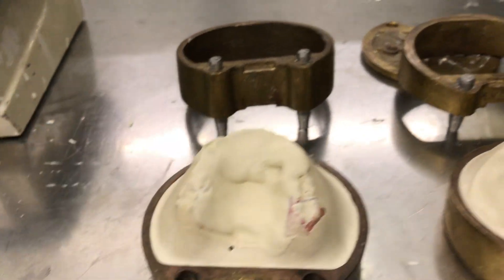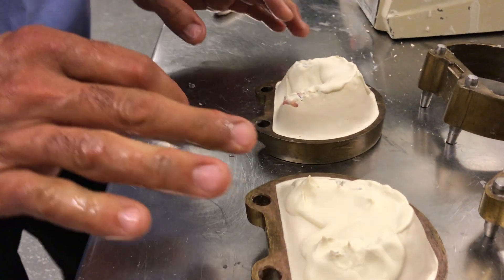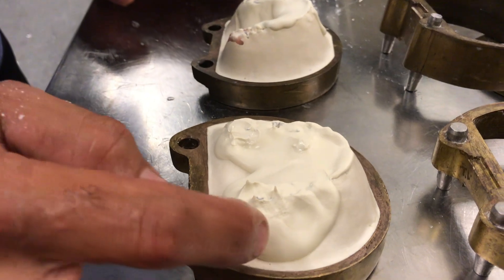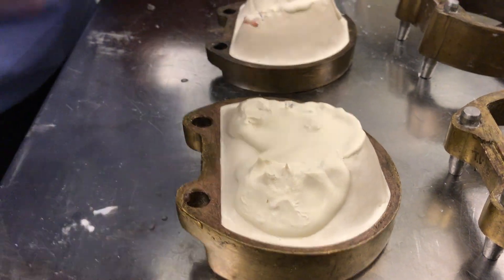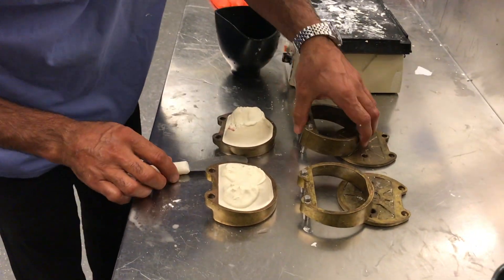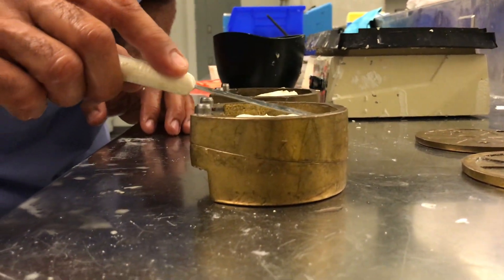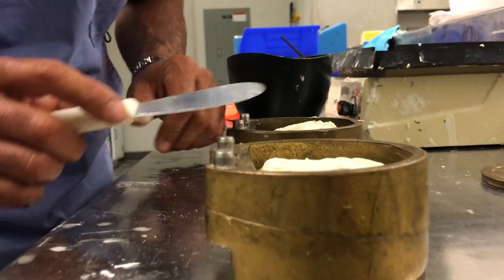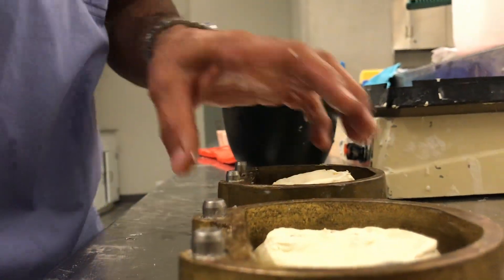You'll see it eventually lose the gloss finish it has — you can see it already going matte, and just upon pressure it's starting to stiffen up, so this is actually ideal. By the time I do my next mix and vibrate it and top it up, it should be just perfect. We should use some kind of stress point here where we can put a little bit of paper to create a stress point to break off most of the plaster. As you can see on this one, we're almost right to the top, so we don't need it there.